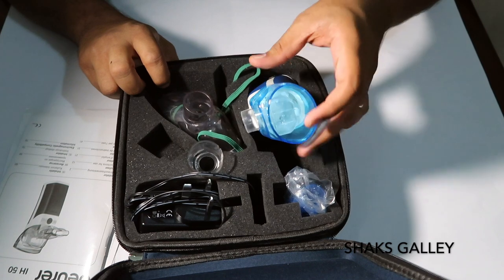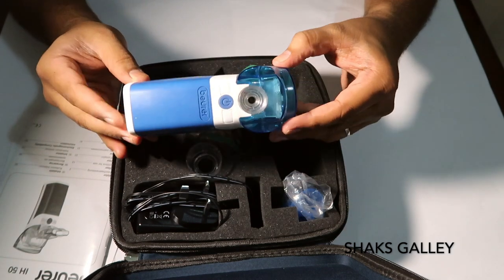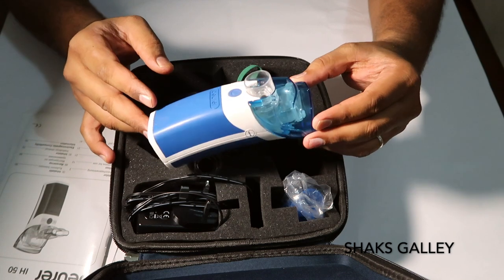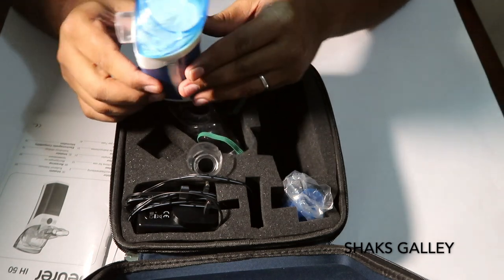It's the main device — a lightweight nebulizer machine. This is an accessory device included with it.